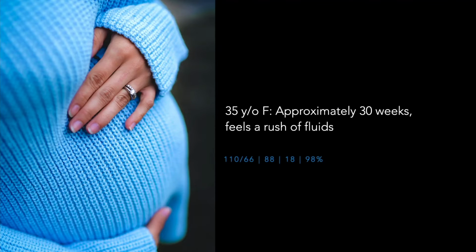Next scenario is imagine yourself seeing a 35-year-old female, so a little bit older. Age really is probably not the most applicable factor in this scenario, but they say, hey, you know what? I think I'm about 30 weeks, right? That's based on my LMP, my conversations with my OB provider, and when our due date is. I should be about 30 weeks and I don't know, let's say 30 and 3, right? 30 and 3.